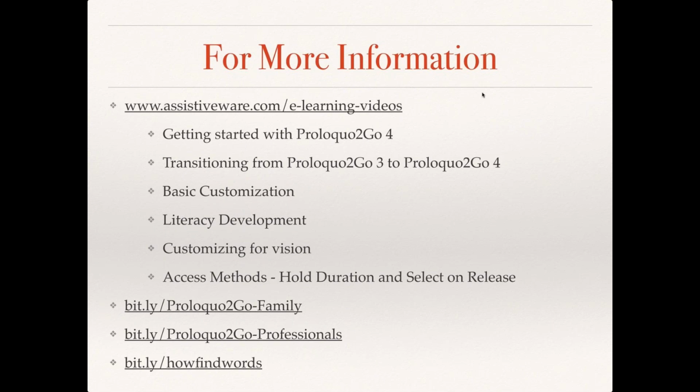And then the very last link, the bit.ly how find words, is a much longer PDF that describes the organizational philosophy behind our Fringe folder. So it kind of goes beyond the core page to where can you find those very specific nouns and verbs. Sometimes that's helpful, since we don't have a search feature, to kind of know the philosophy behind things, so that it will be easier for you to find some of the words you may be looking for. And we are working on a search feature in the future. I would say pretty much 150% of our users have asked us for this, and so we kind of think we should have it.